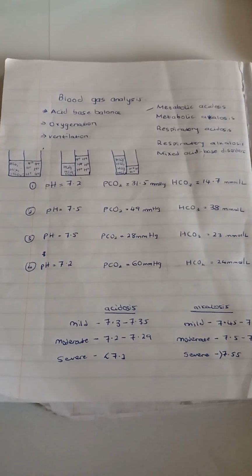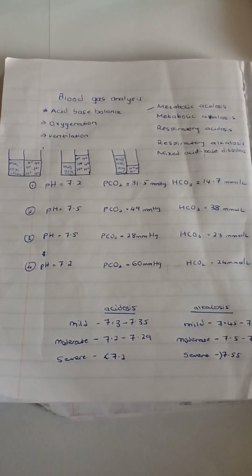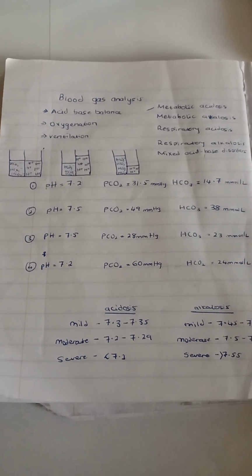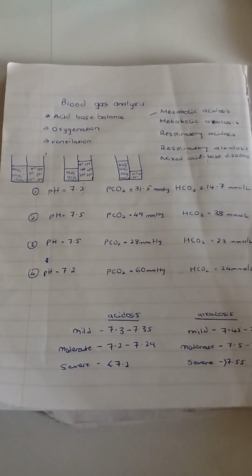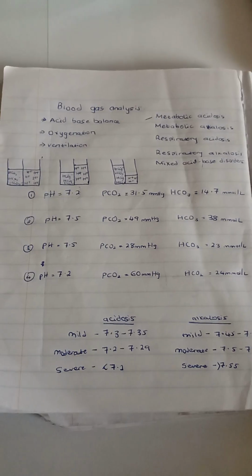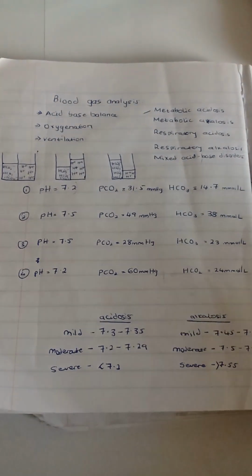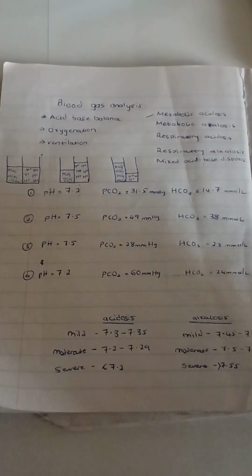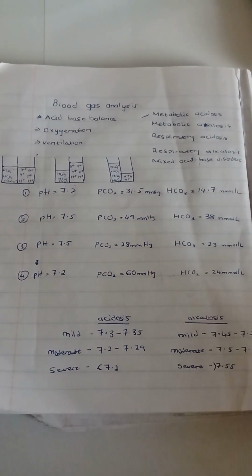Here we will focus on the acid-base balance disorders. Basically, we have 5 acid-base balance disorders: metabolic acidosis, metabolic alkalosis, respiratory acidosis, respiratory alkalosis, and mixed acid-base disorders. Mixed acid-base disorders we will talk about in another video. Here we will focus mainly on those 4. The pathophysiology of these 4 conditions also we'll talk about in another video. Here we are focusing only on the interpretation of BGA, how a blood gas analysis will tell us what type of acid-base disorder a patient has.